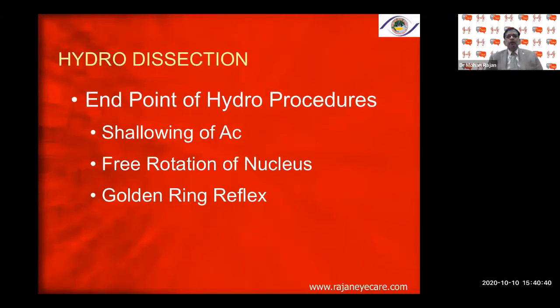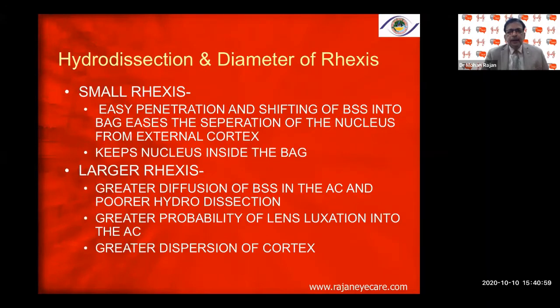The endpoint of hydroprocedures in very dense cataracts: shallowing of the anterior chamber, golden ring in hydrodelineation, free rotation of the nucleus, and forward movement of the nucleus. A smaller rhexis allows easier penetration of BSS and better separation of the nucleus from the external cortex, keeping the nucleus inside the bag. A larger rhexis means greater BSS diffusion in the AC and poorer hydrodissection, with greater probability of lens subluxation.